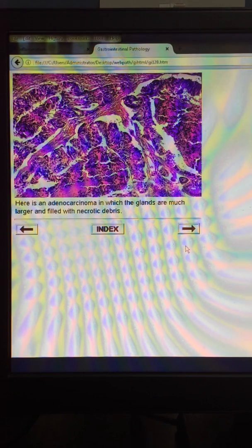This is another example of histologic appearance of adenocarcinoma in which the glands are large, irregular, lined by the malignant epithelium, and there are wide areas of central necrosis known as garland necrosis. The presence of dirty necrosis within the lumina is a highly suggestive feature of colonic origin, especially in cases of metastasis either to the liver or lymph nodes.